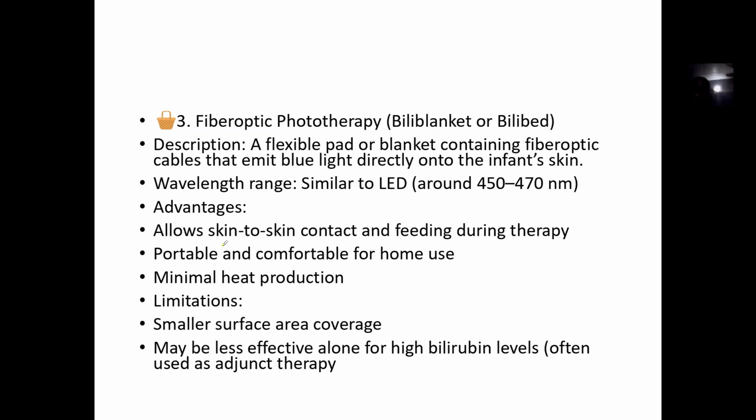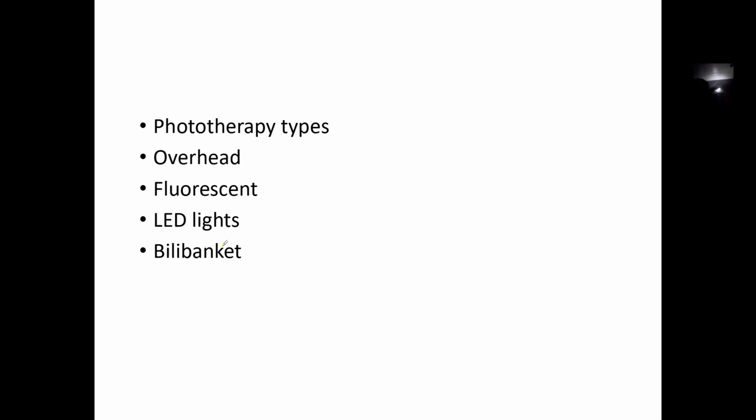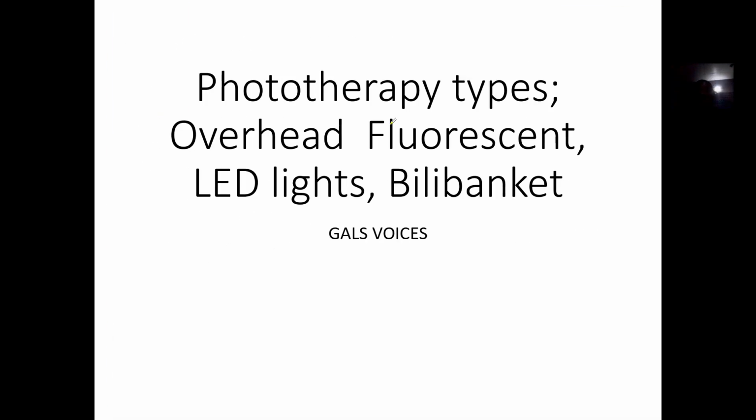It allows skin to skin contact. It's portable and comfortable for home use. There's minimal heat production. It covers a smaller surface area, and it's not as effective as the other ones. So that's what we have for the types of phototherapy.